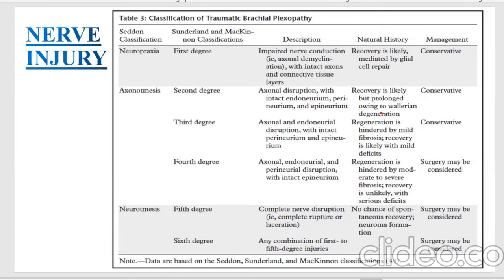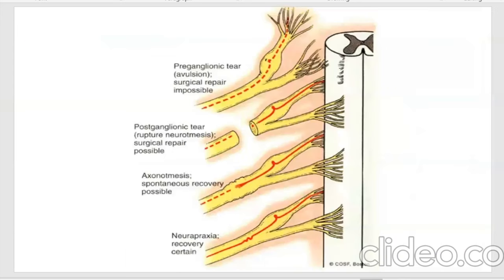In this image, we can see various types of injuries. The last one is neurapraxia, the second last is axonotmesis, then the second one is postganglionic, and the first one is preganglionic.